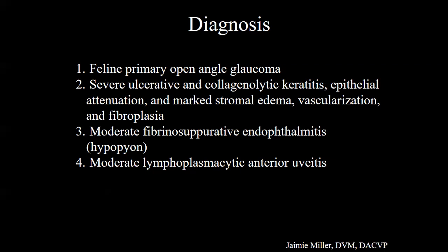I just want everybody to kind of think about that, because they're going to be seeing it. If I look at that, that's not going to be the top of my list, it's going to be granulation tissue. It was a little odd, which is why I brought it. Granulation tissue, lymphoma, squamous cell carcinoma for sure.